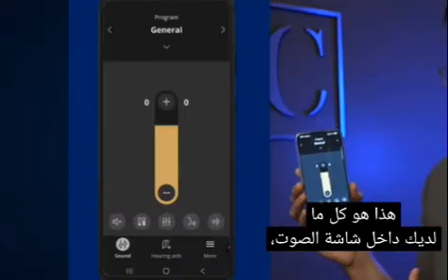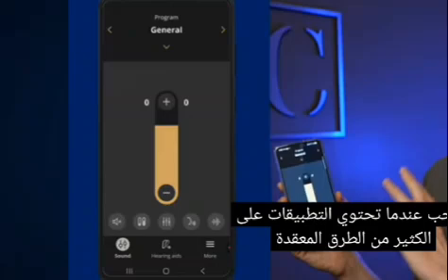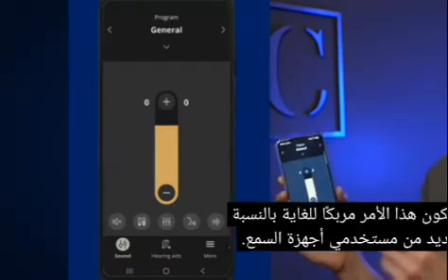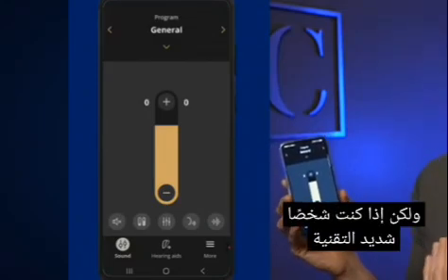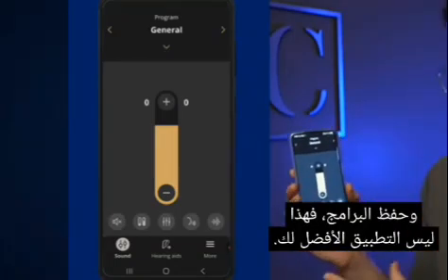That is pretty much all you have inside of the sound screen, which I actually really like. I do not like when apps have a lot of complex ways to manipulate and save new programs and all of that. That can be very confusing for a lot of hearing aid users. But if you're someone who's overly technical and you want to be able to manipulate little things and save programs, then this is not the best app for you.